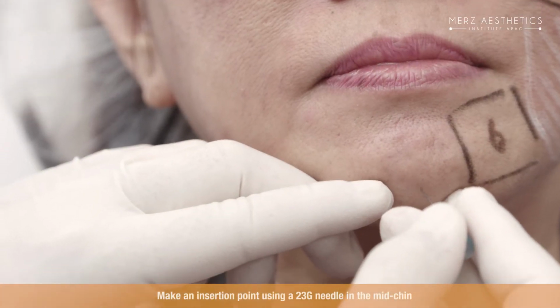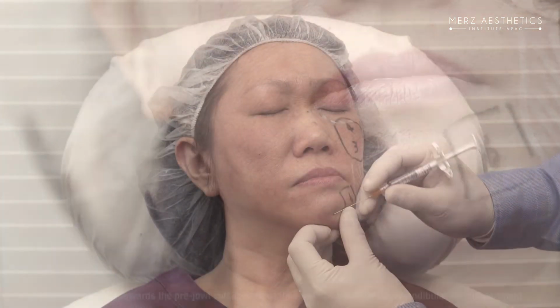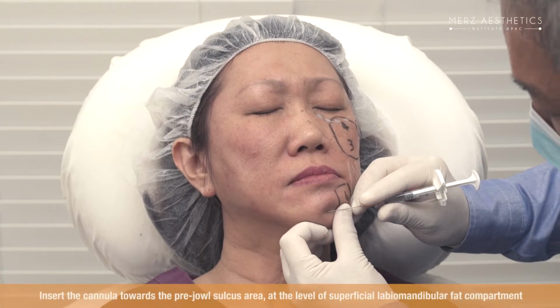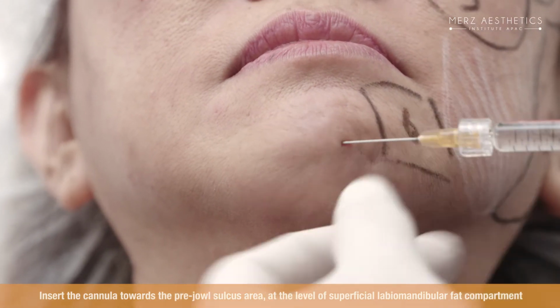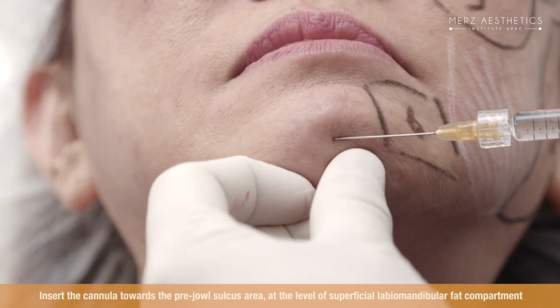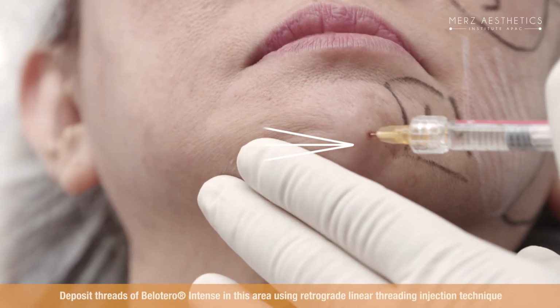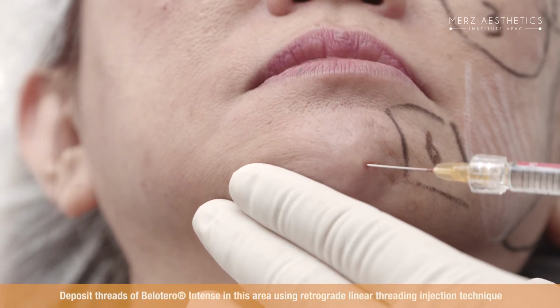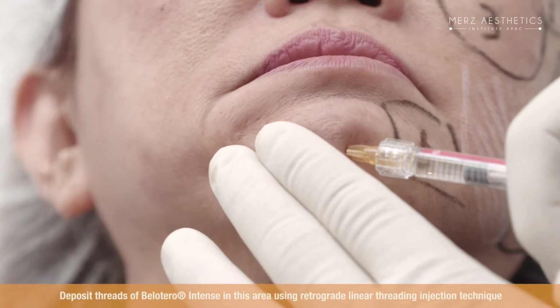Make an insertion point using a 23-gauge needle in the midpoint of the chin. Insert the cannula and advance the cannula to the pre-jowl sulcus. The target area plane for this injection area is the superficial labiomandibular fat compartment. Deposit threads of Belotero Intense in this area. Tension in this area has a suspension effect on the adjacent jowls.